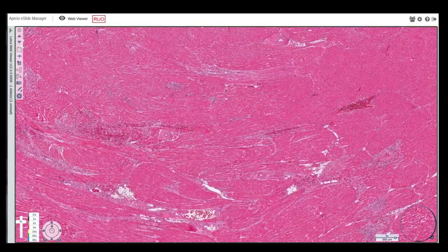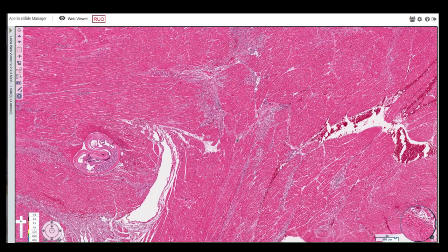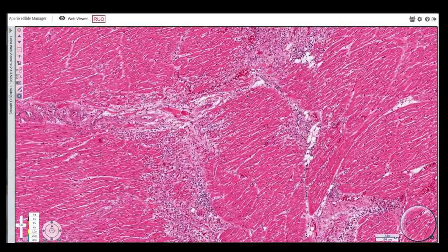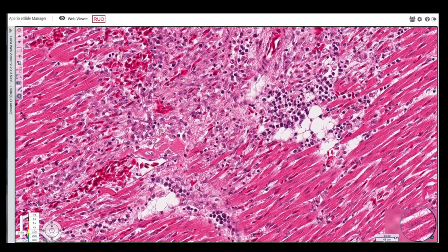I thought that the problem with the swan was the presence of the nematodes, but when I went back and read the answers, it turns out that they weren't the cause, and that actually there are further bits of inflammation within the heart muscle. So we'll have a little look at those.